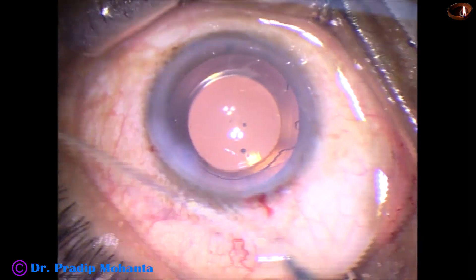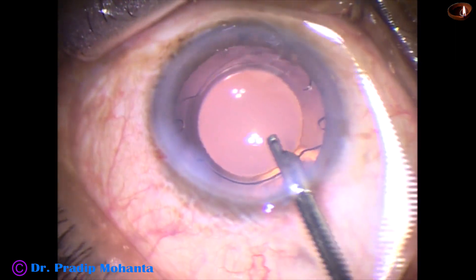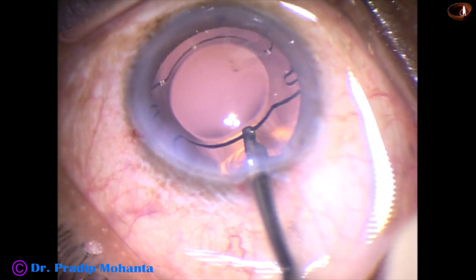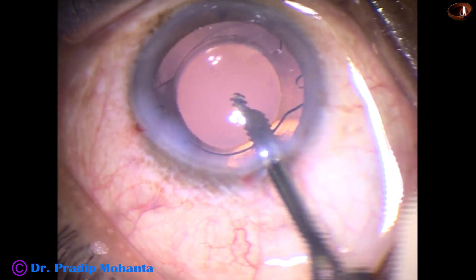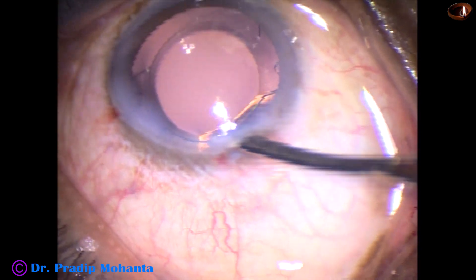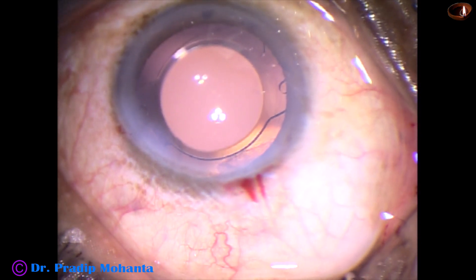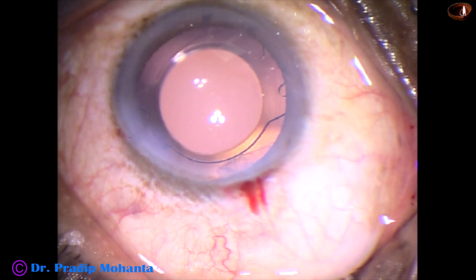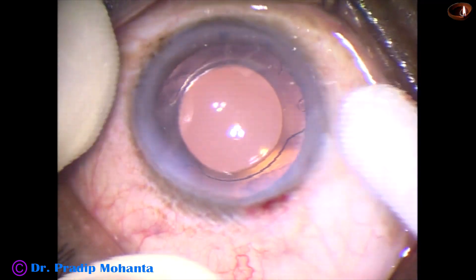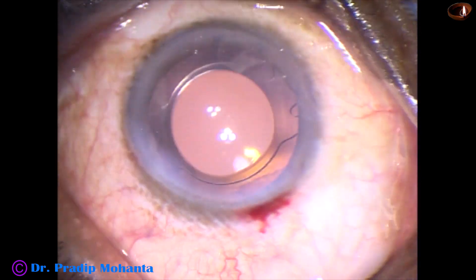Now, this is the final lavage of the anterior chamber. Whatever visco sticks to the corneal endothelium is removed. Irrigation and aspiration of the capsular bag is also done, and the anterior chamber is formed very nicely. We just have to check the integrity of the wounds before we remove the speculum. A few drops of moxifloxacin is also applied over the ocular surface. And the case is concluded.